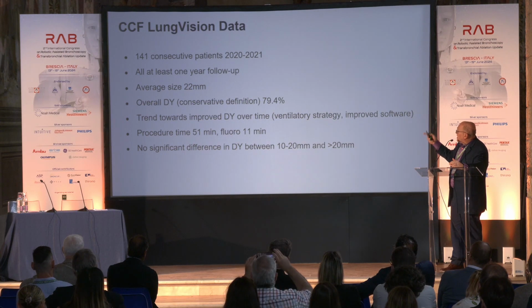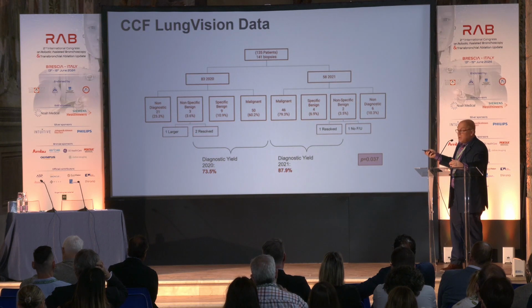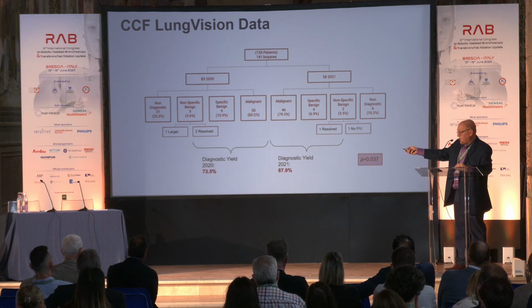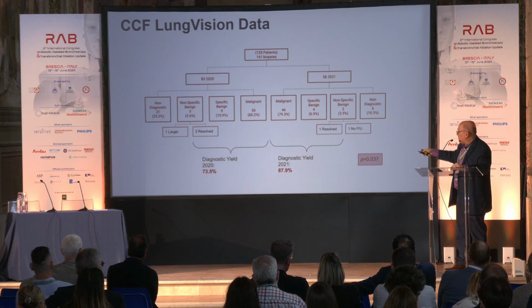This is our own individual data when we were collecting this, and you could see what Dr. Folk said yesterday, how technology advances yield. You could see that early on, our yield was about 75%, and after several upgrades, we got our yield up to about 87, 88%.